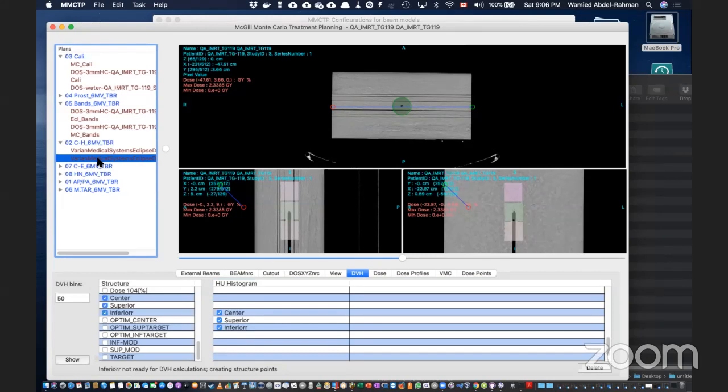Okay. So it's different. This one was a PhD work by one of my colleagues, Andrew. And I think he did a decent job. There are a few people who are actually working with this, because I see people reporting bugs. And please, if you become a user and there are bugs, or things you wish it could do, just go to the Git page and put it there, because that's how developers will know that there are bugs and so on.